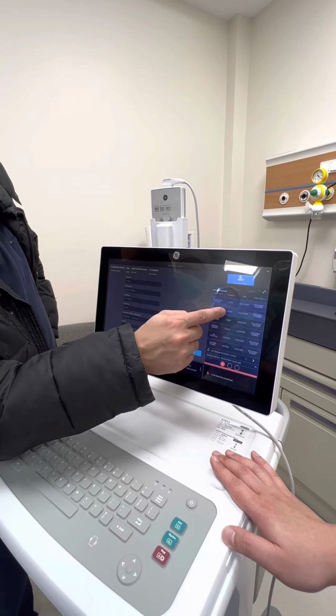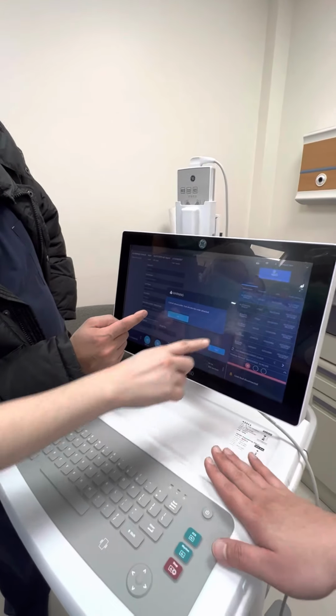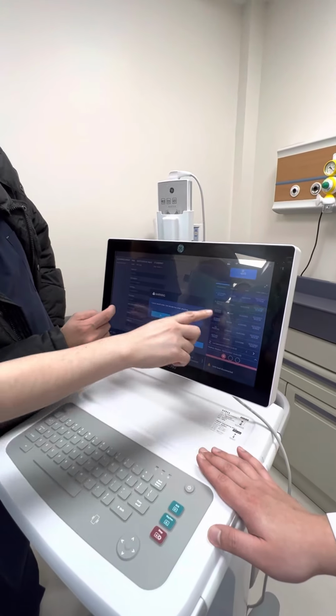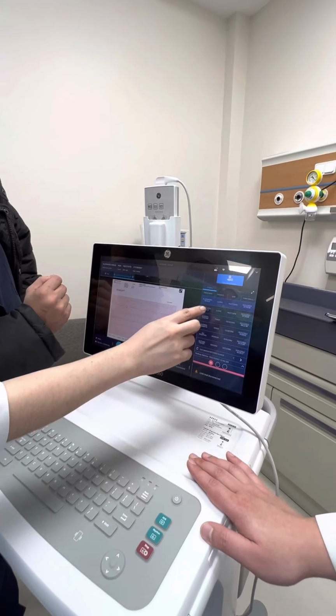Once the initial stage is over, because most of the patients, they do ECG first. Some of them may already have an order attached. If by mistake we attached the wrong patient's ECG and we want to remove it, actually we should have that option also.